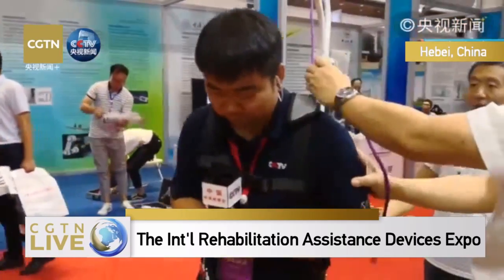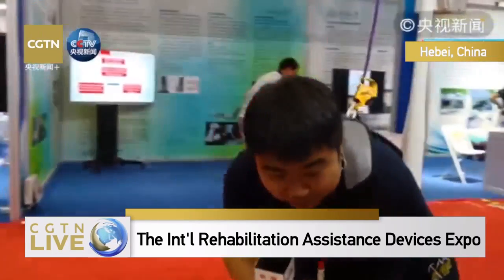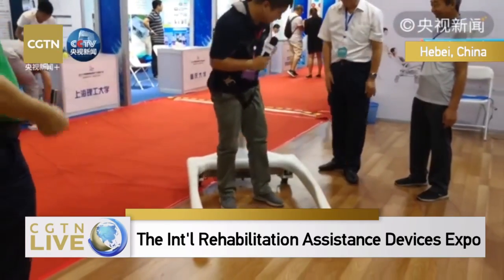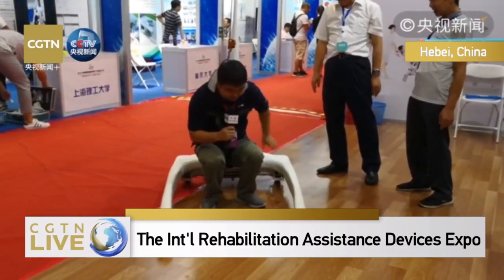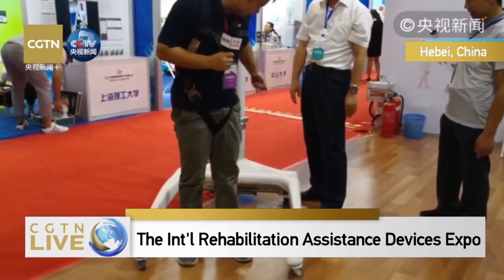I think it will be much easier for someone to walk, especially someone with mobility difficulty. Can you squat and hold up your feet? Let's try walking.